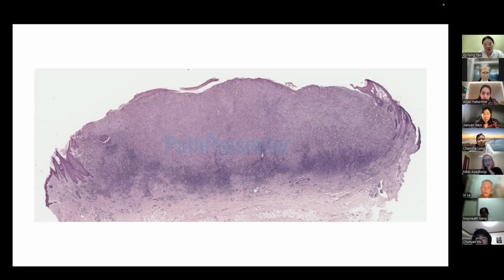Now we think it's a neoplasm. Do we think it's benign or malignant? Something to remember is that in each organ, malignancy and benign can have very different features. In some neoplasms, even one mitosis is considered an atypical malignant process, but there are some tissues that have more mitosis.